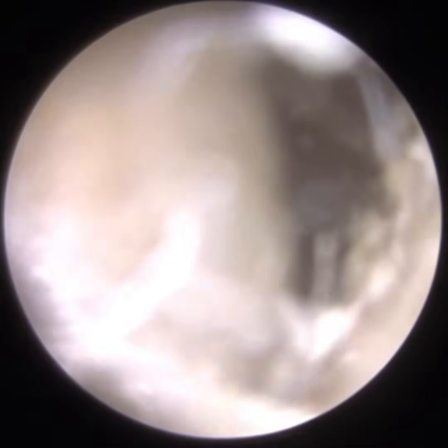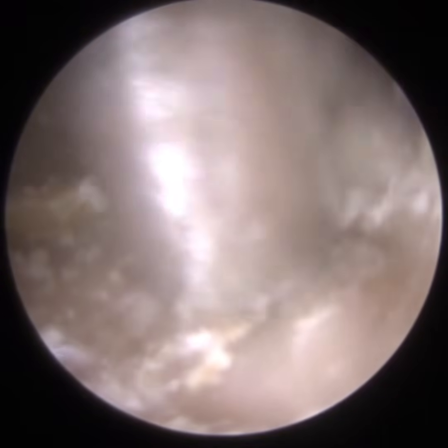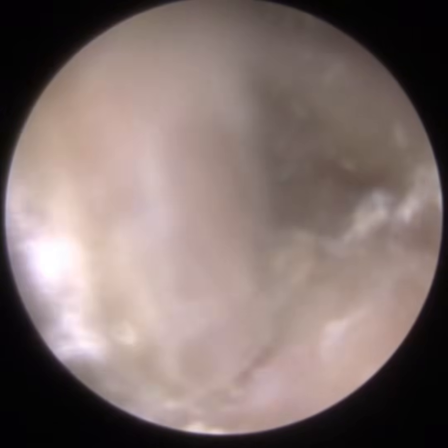So, a patient who attended with bilateral otitis externa. Otitis externa is an umbrella term given for an infection and/or inflammation of the outer ear canal and the outermost membrane of the eardrum. The eardrum is composed of three membranes. The patient has to attend quite regularly, I would say every 5 to 6 months.